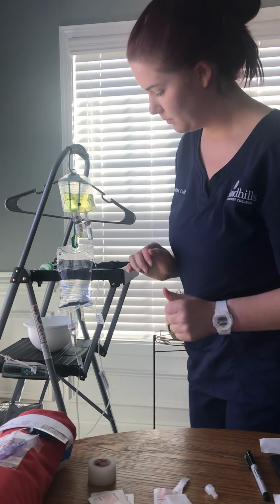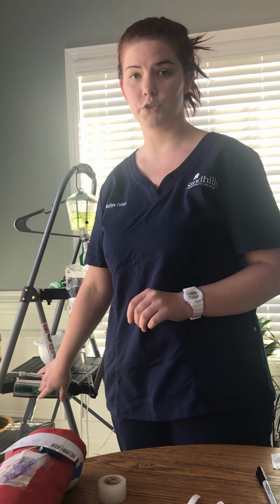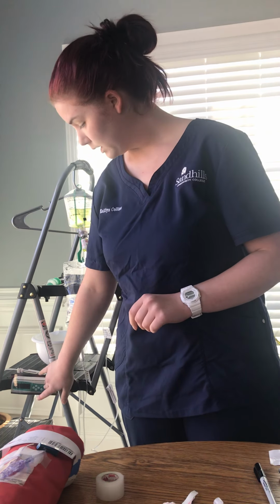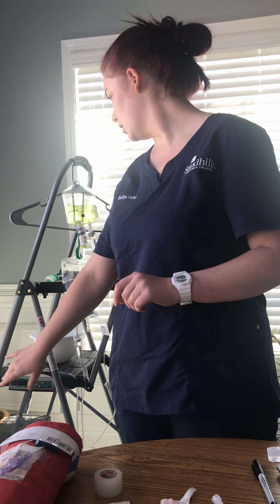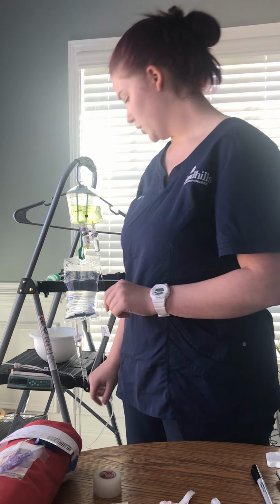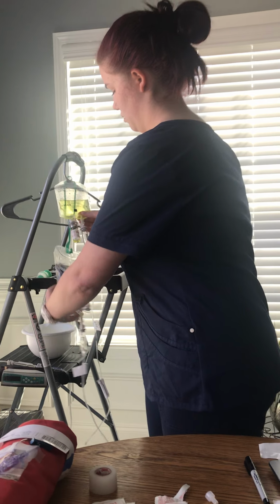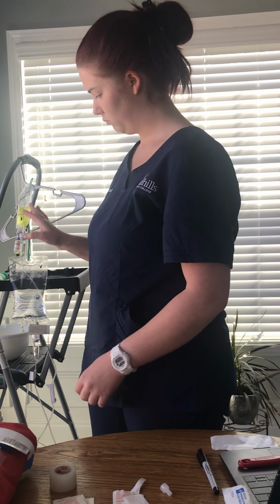All right, and again, just to reiterate, I'll put this at 100 milliliters per hour, which this was already set up as, so that's a good rate.